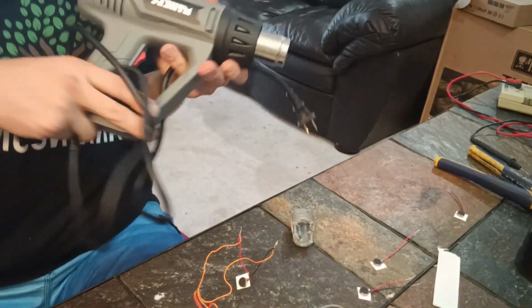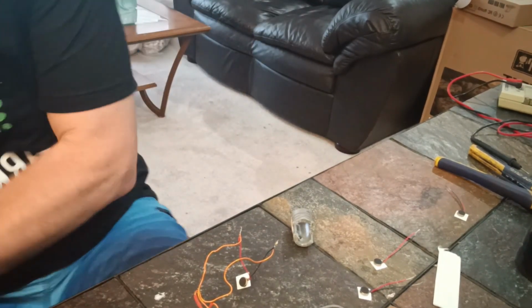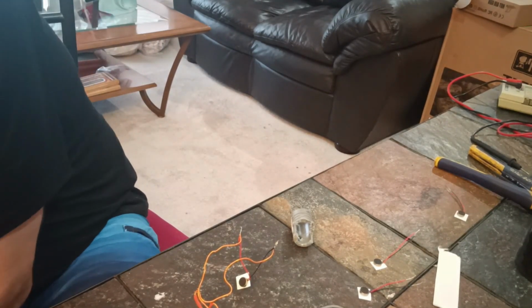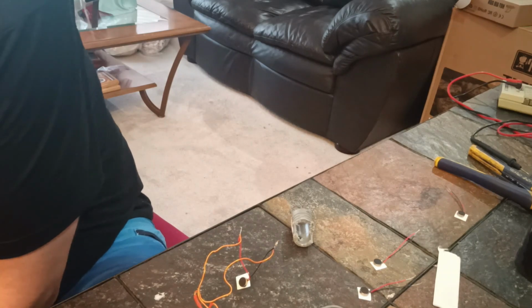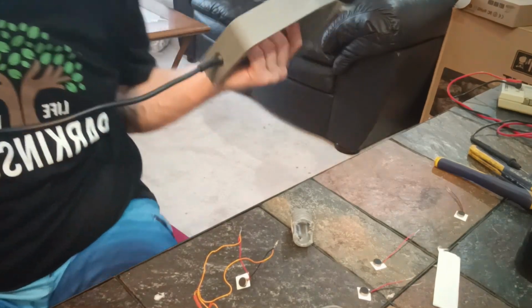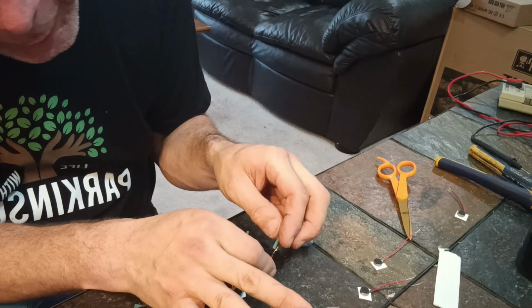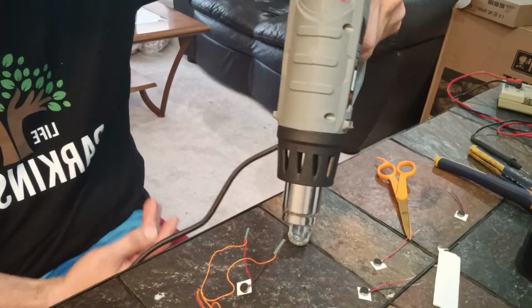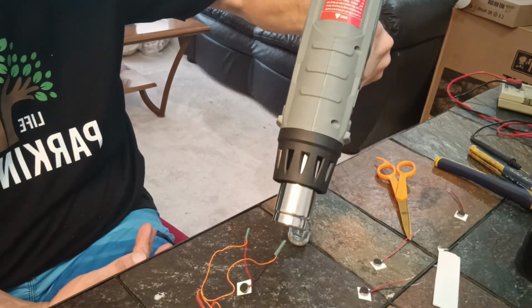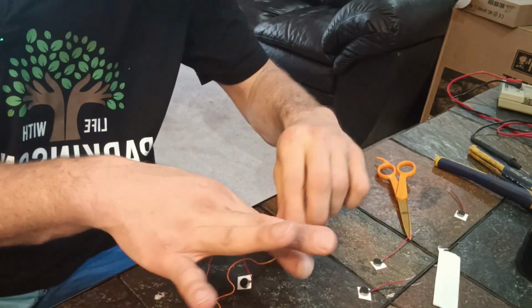And I did buy a new heat gun because, well, my Haley wanted her blow dryer back. Did find a good deal on Amazon. Thankfully, I've never heard of this brand, but hey, it works. And the heat shrink just helps hold the connection as well. Works much better than the blow dryer did.